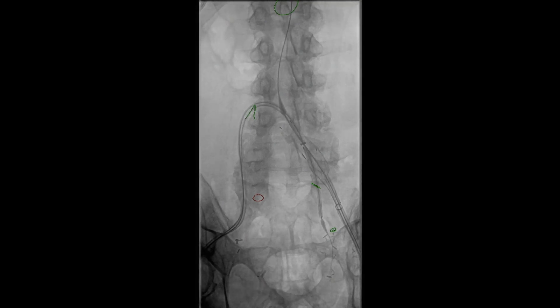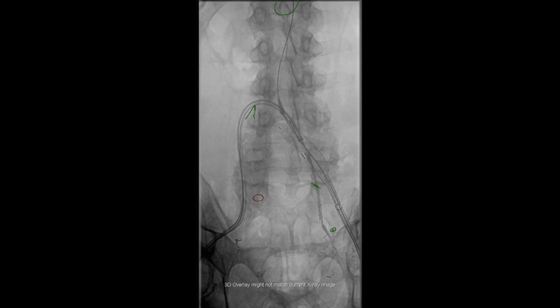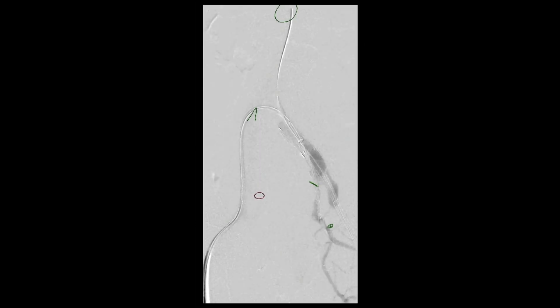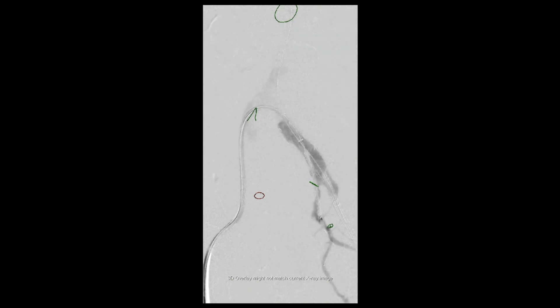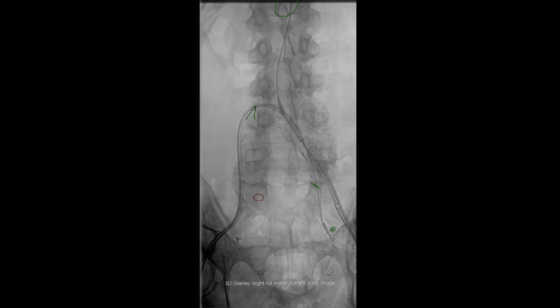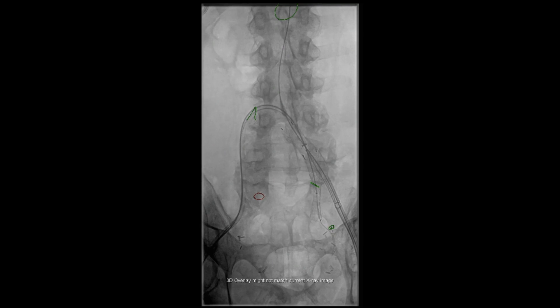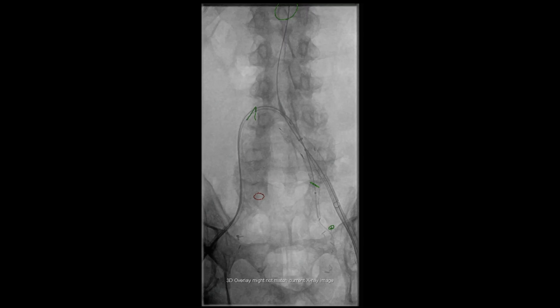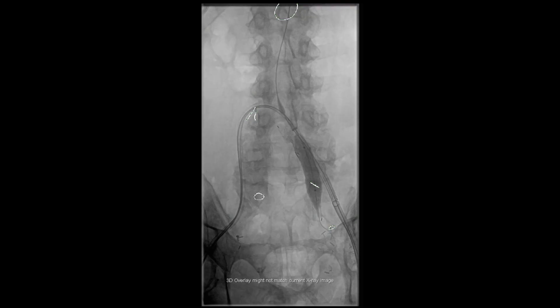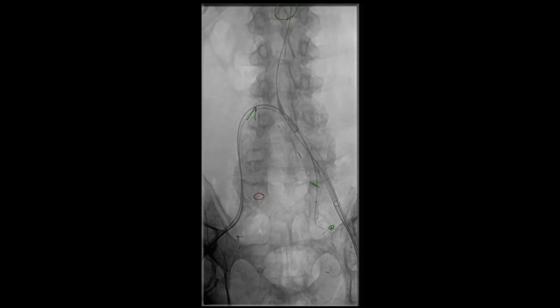Prior to deploying the stent, we performed an angiogram to make sure that the stent is in appropriate position in the left internal iliac artery. Once the appropriate position of the left internal iliac artery stent graft is confirmed, we proceeded with deployment of this stent graft. Balloon angioplasty of this internal iliac artery stent graft is then performed to ensure proper apposition of the stent graft to the walls of the artery.